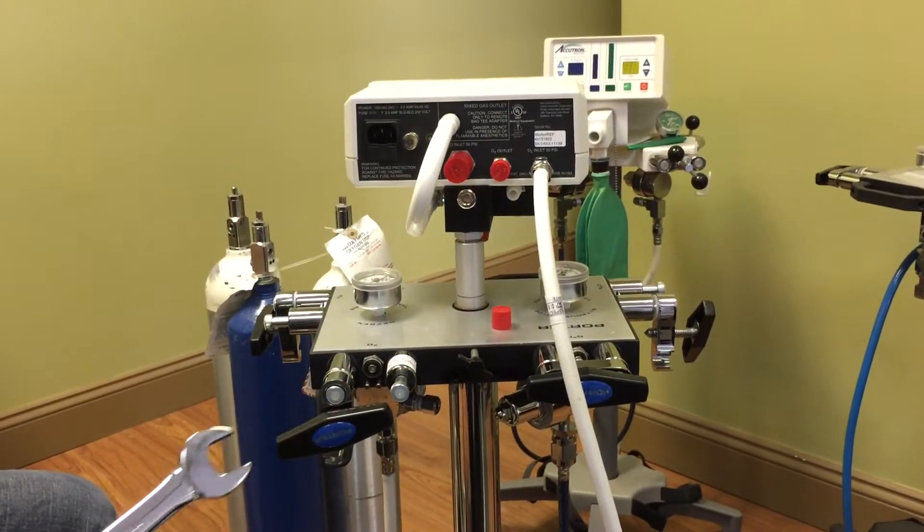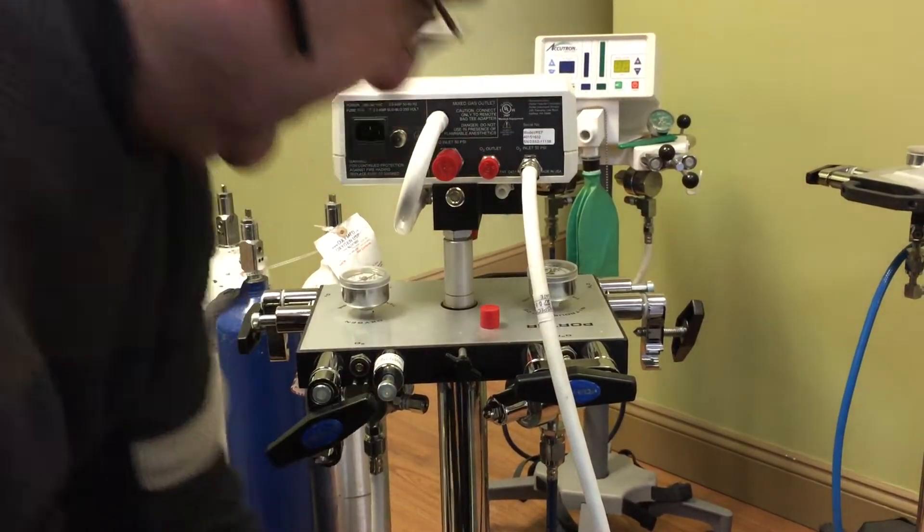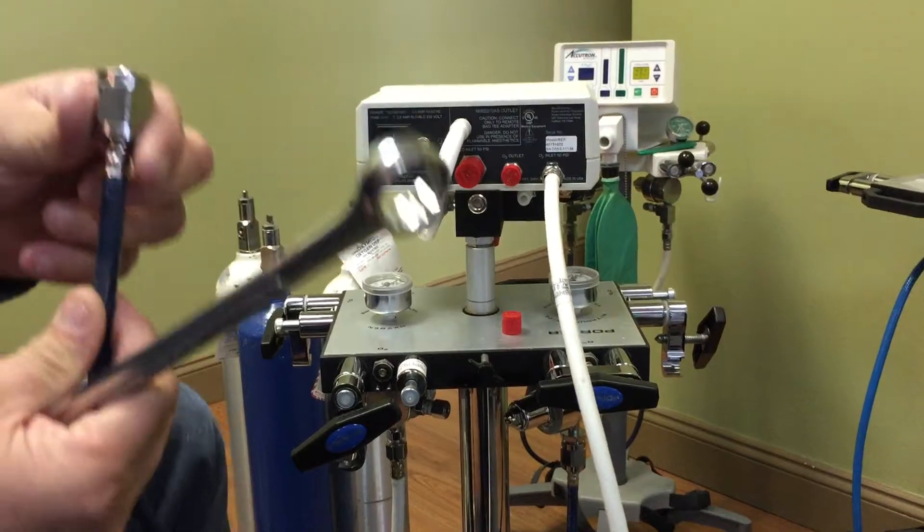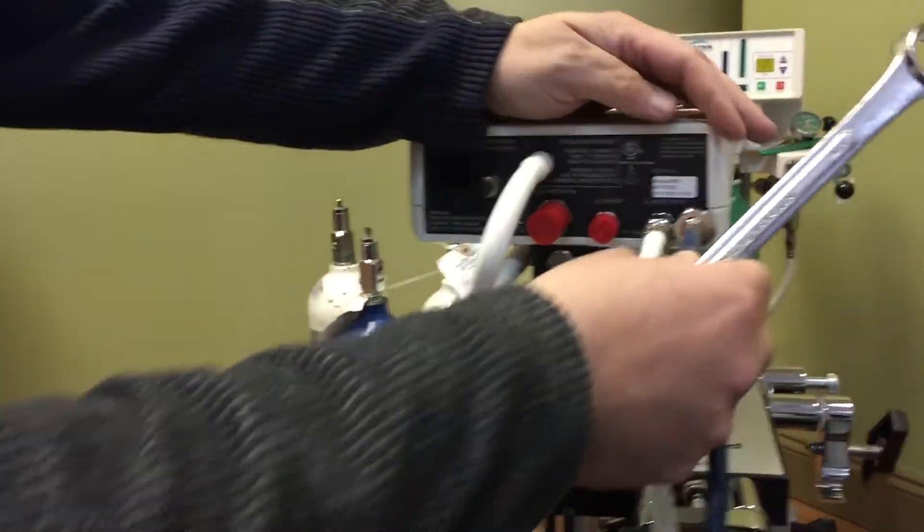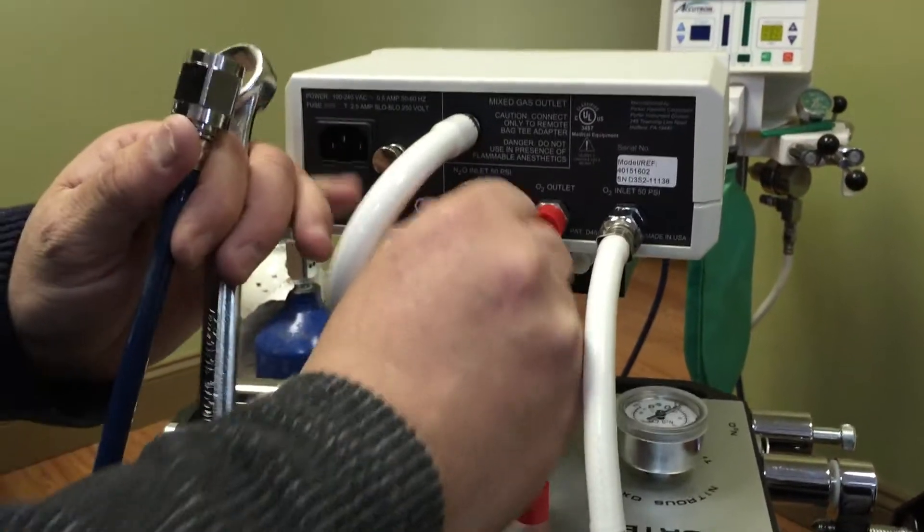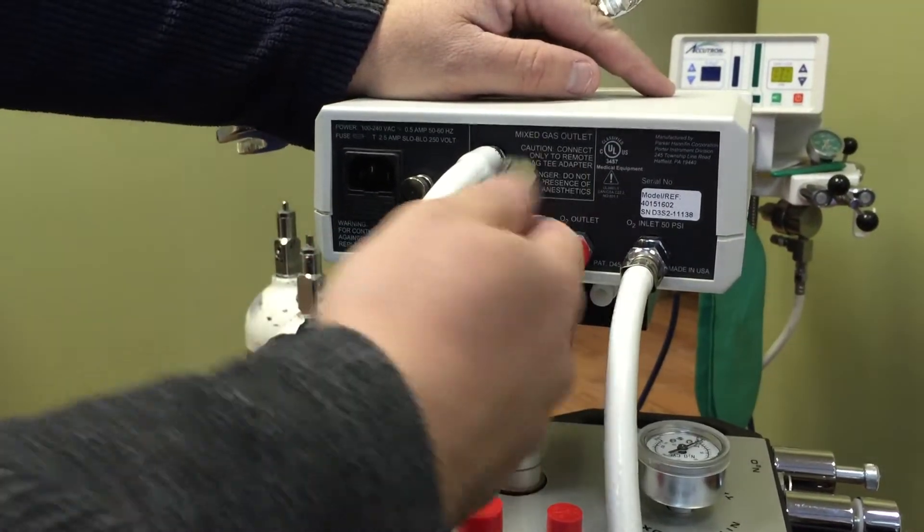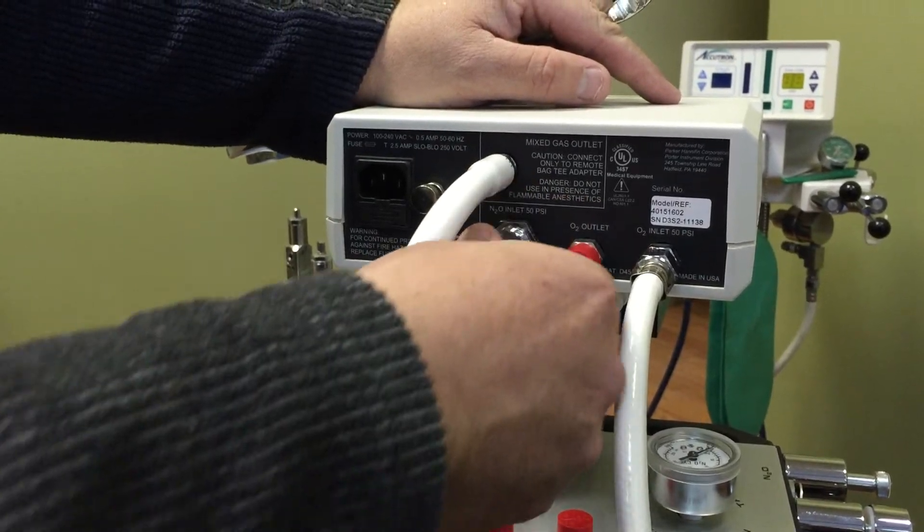Now, once that's done and we know everything is snugged up, we're going to do the nitrous line. The nitrous line, totally different connection, safety reasons. Nothing will connect unless they're made for each other. So nitrous goes on here, nothing to worry about. You can't mix anything up. And this is going to be a nitrous gas that's going in.